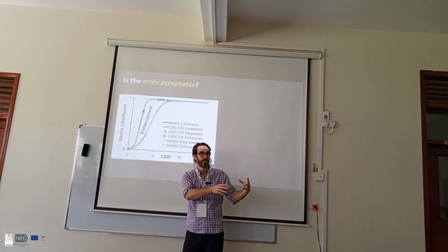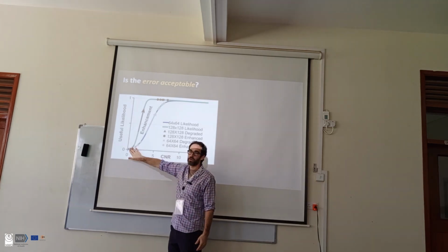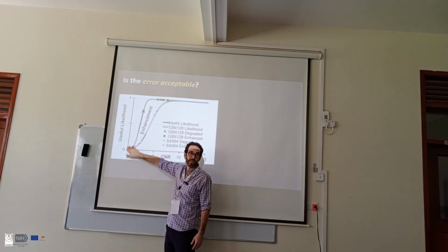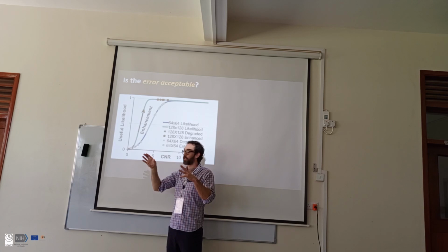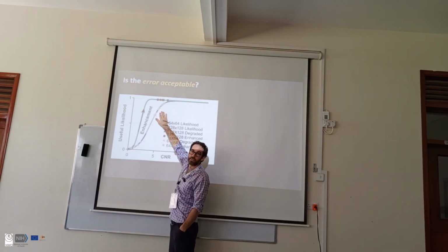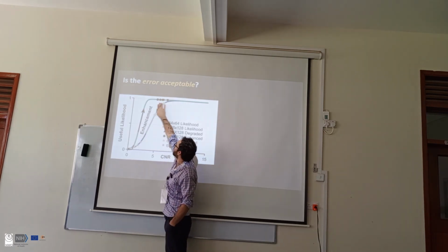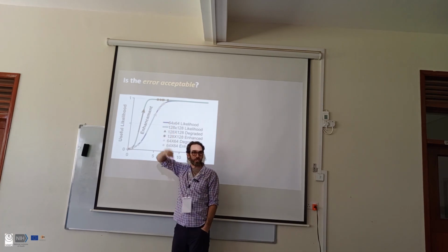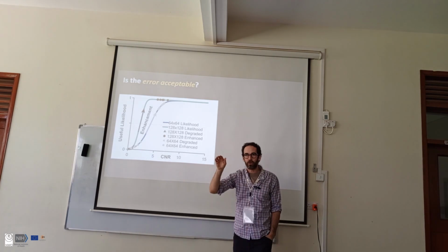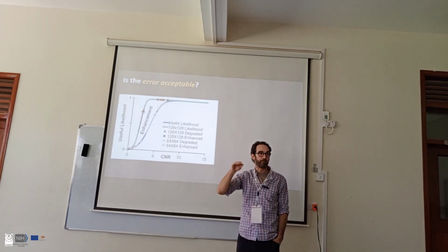So the bad images that we ended up enhancing all had really low contrast to noise ratio and really low usefulness likelihood. After the machine learning, their contrast to noise ratio all popped up significantly, and so did their usefulness likelihood. So the path from here to here with these data points is the machine learning. And we see that in the data. Almost all of the machine learned images were considered useful from part 1 information, right?